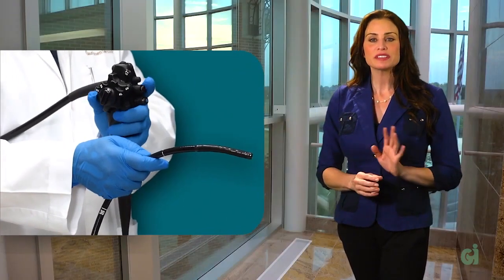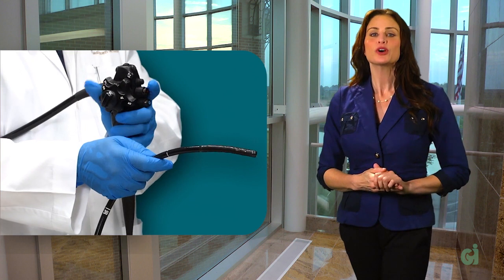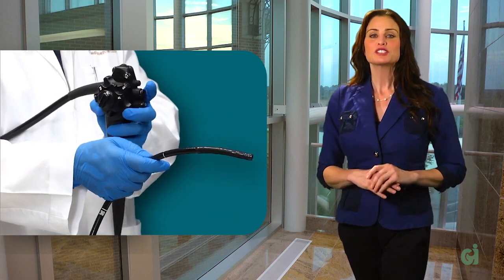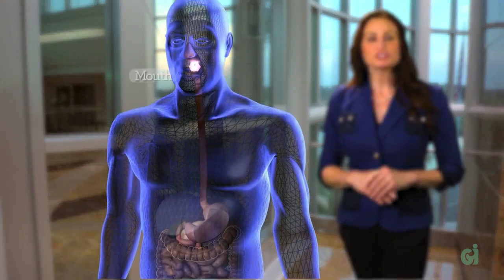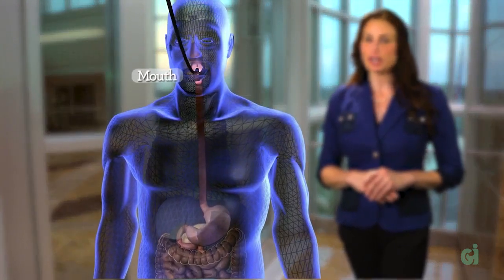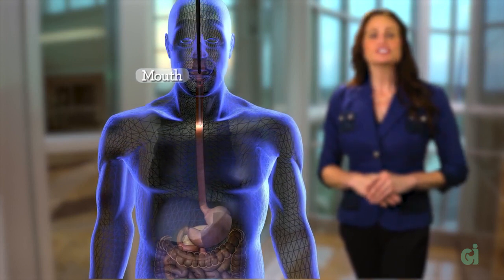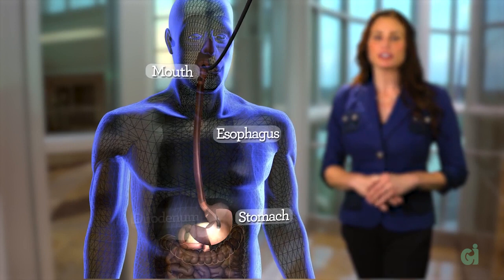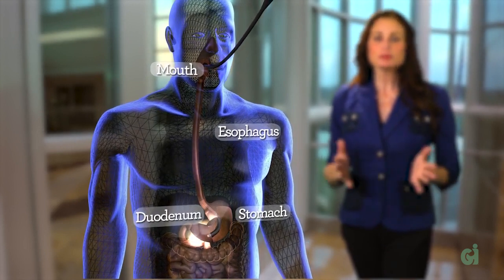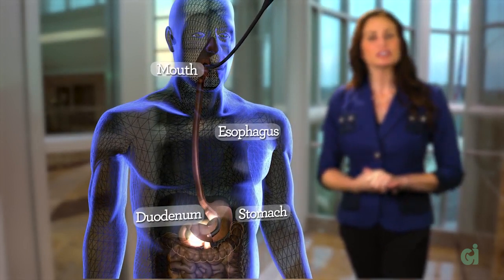This is an endoscope. On one end is a camera that's guided by a set of hand controls with precise movements. Small openings on one end allow instruments, air, and light to pass through. The endoscope will be inserted into your mouth and guided through the upper GI tract. Your doctor will examine your esophagus, stomach, and duodenum on a monitor as the scope is advanced, possibly pausing occasionally to inflate certain areas with air for a clearer view.